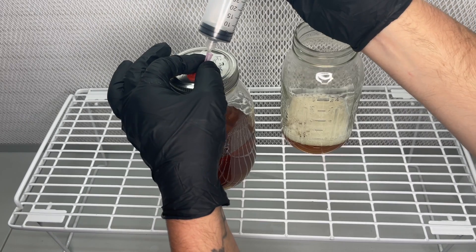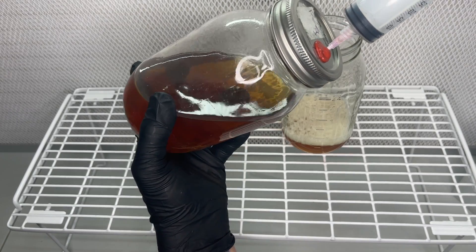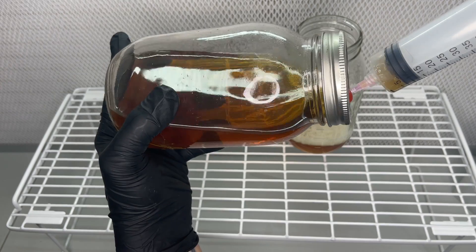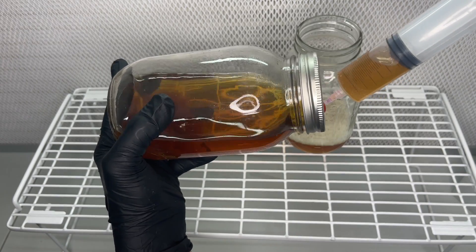At this point I'm extracting approximately 240ml from the jar and then replacing it with 240ml of fresh honey water. For my liquid culture media I always use one tablespoon of honey to 600ml of water.